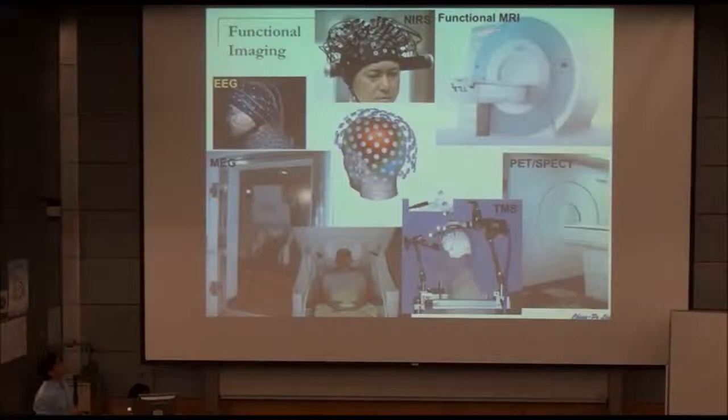And functional MRI and near infrared are other techniques. For both methods, they detect the blood function, the blood flow. For example, NIRS detects oxygenated hemoglobin and deoxygenated hemoglobin, because they have different wavelengths. So using optic detection, we can detect both signals of the brain, and then we can reflect the brain function. So that's another technique. And MRI uses a similar source, which I will introduce later.